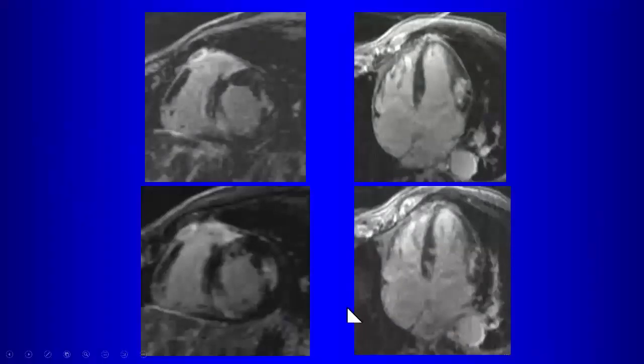And then when we look at myocardial delayed enhancement, we notice that there are these multifocal regions of myocardial delayed enhancement, not in a pattern associated with infarctions. A lot of it is mid-myocardial. It's more than one vascular distribution. Some of it is also globular, as you can see.